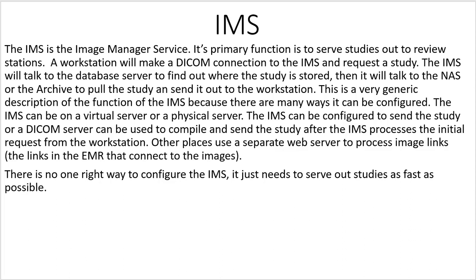And this is a very generic description of the function of the IMS because there are many ways it can be configured. The IMS can be a virtual server, a physical server. It can be configured to send the study, or a DICOM server can be used to compile and send the study after the IMS processes the initial request from the workstation. Other places use a separate web server to process image links, like the links in an EMR. There's no one right way to configure the IMS. It just needs to serve out the studies as fast as possible. And everybody will configure it differently, but all IMSs do that same basic function, which is serve out images to the people who want to see them.